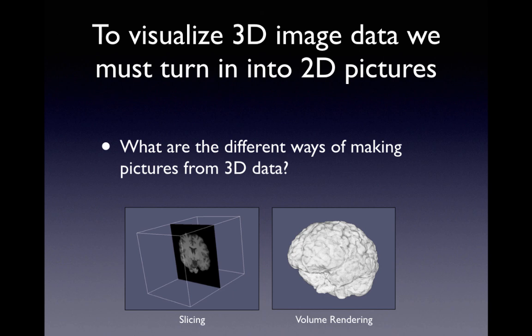You might have three-dimensional data traced to look like two-dimensional. I mean, you can have depth information, not just surface information. But this is a visually nice way of looking at data, but it doesn't give you as much information about precise values at a precise location as slicing does. So slicing is more limited because you're only looking at one aspect of the image, one plane through the image, but it gives you more complete information than volume rendering. So we're going to be mostly visualizing using slicing.